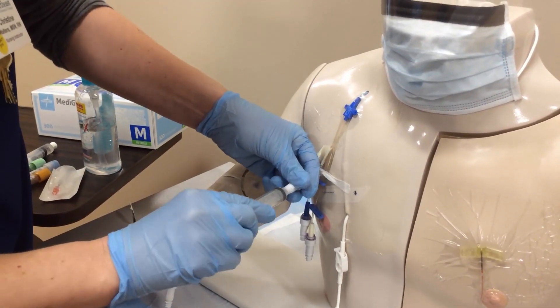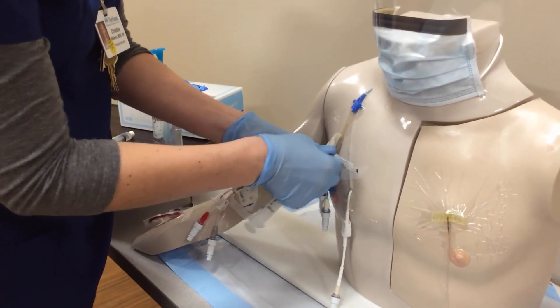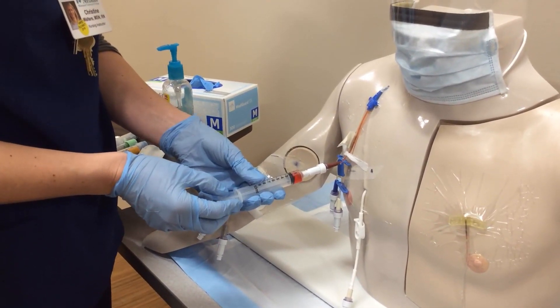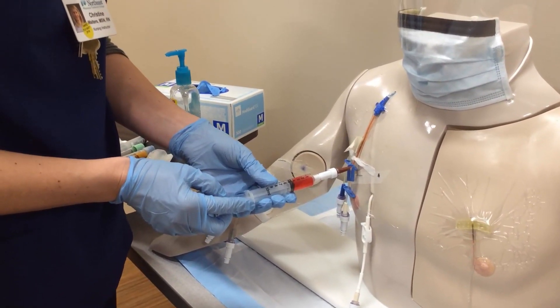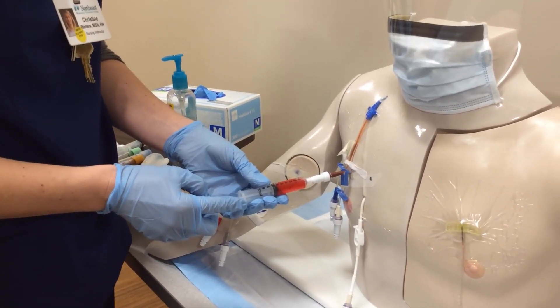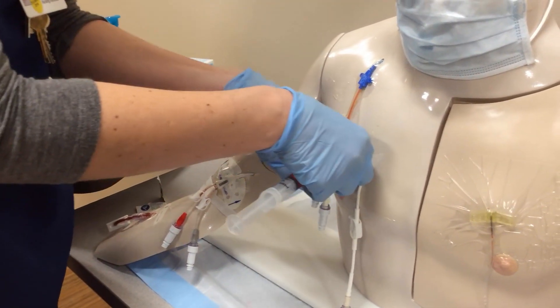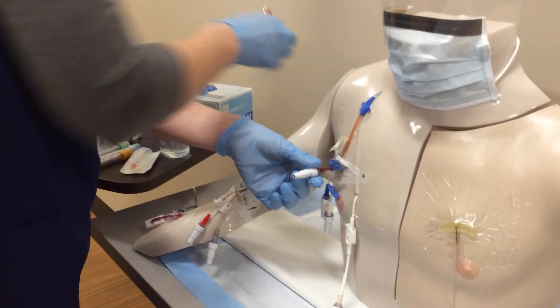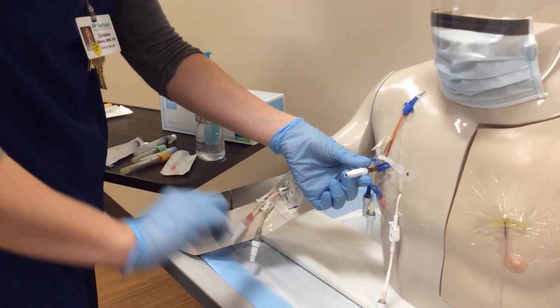I'll grab my 10cc syringe that is empty and hook it on there. I'm going to open up the clamp to my central line and slowly pull back 5 to 10 mls of blood for waste, depending on what my facility's policy is. I pulled at least five. Next I'm going to clamp that central line again, disconnect the waste syringe, and dispose of it in the appropriate receptacle.